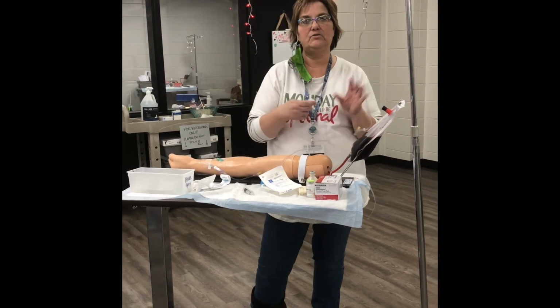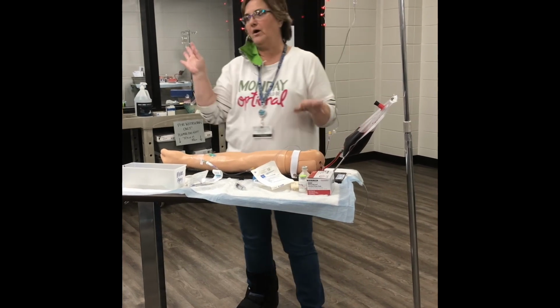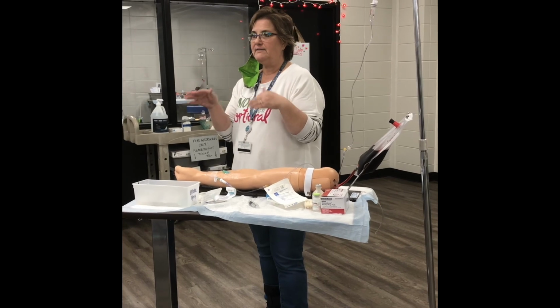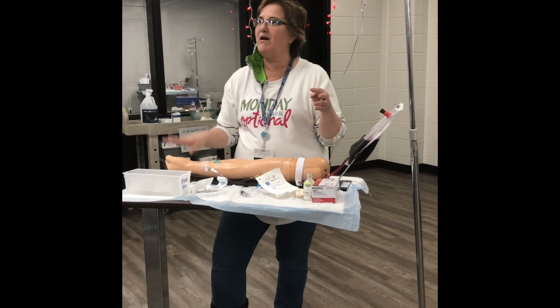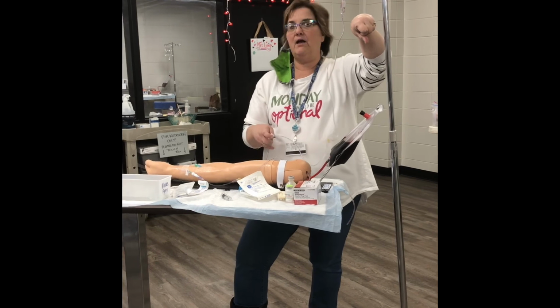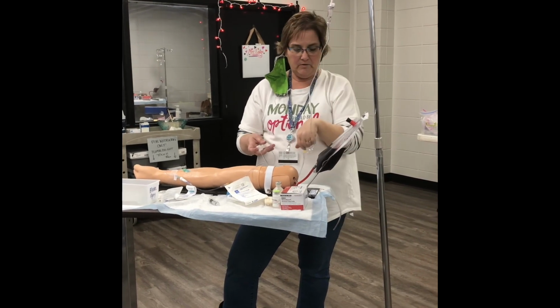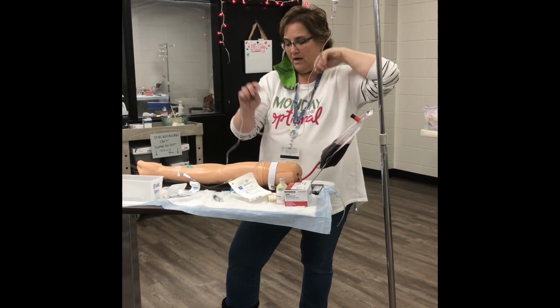And that's setting the drops per minute. All right, so if we did our problem, 100 times 10 drops per minute divided by 60, and let's say we got 32 drops per minute, and I don't know if that's what you'll get or not, but say you got 32 drops per minute. You are going to put your watch up here, and using this, count drops like you count pulse, all right? 1. All right, so can you put your watch down here? Because every time you look down, you miss a drop. You're going to have to hold it up here.